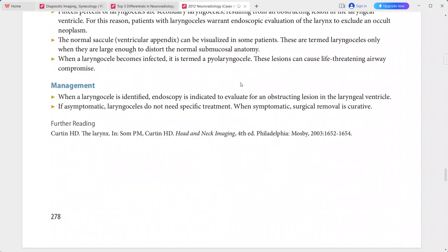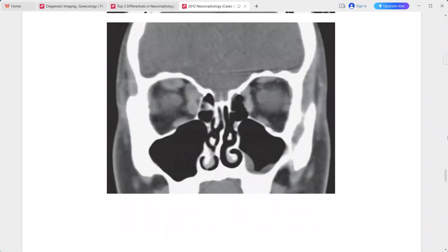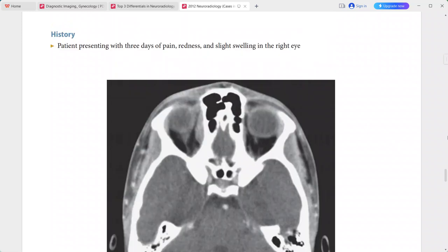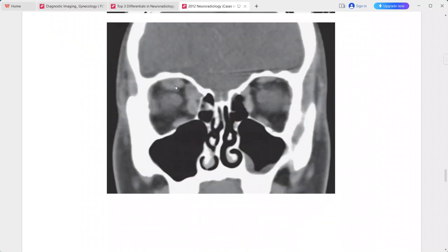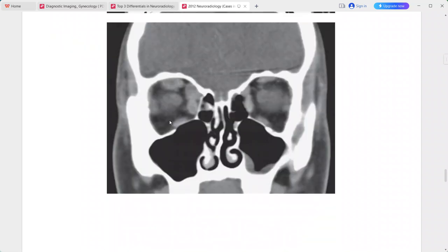Next, a patient presenting with three days of pain, redness, and slight swelling in the right eye. There is enlargement and thickening of the superior oblique muscle including its tendon, the superior rectus muscle, and the medial rectus muscle on the right side.